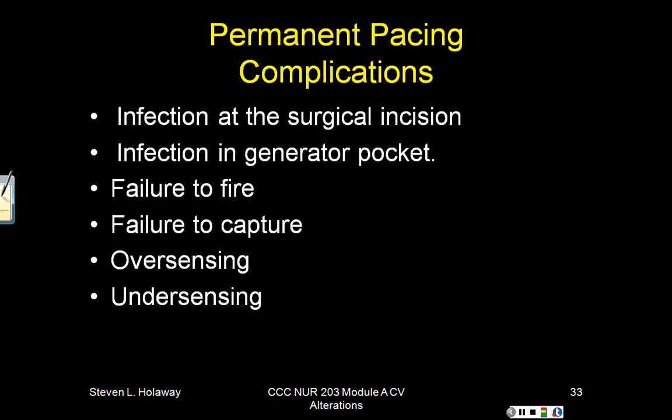So what are some of the complications of permanent pacemakers? Well, of course, anytime you have anything that's invasive, remember that pacemaker generator is actually placed in a pocket just under the skin, and then has leads that go into the venous system.